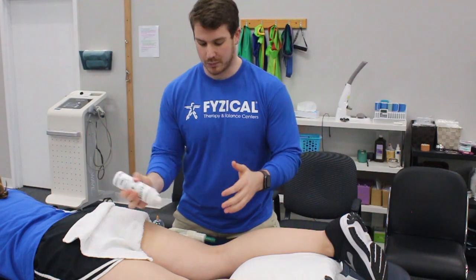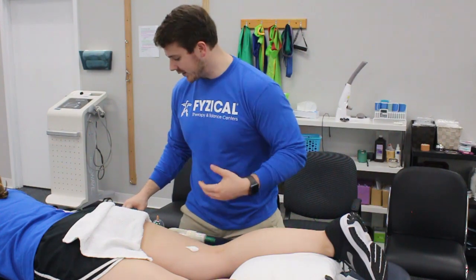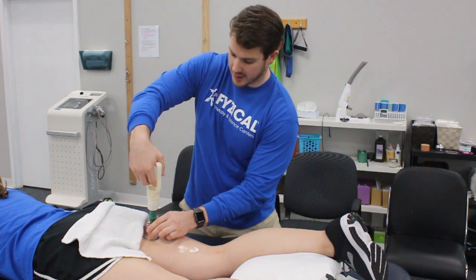First things first, we always put some type of lubrication down so that the cups can glide or slide if we need them to. What I'm basically going to do is just follow the length of the muscle with the cups.